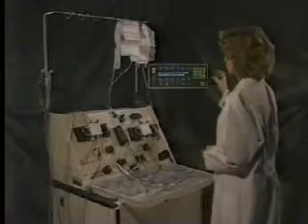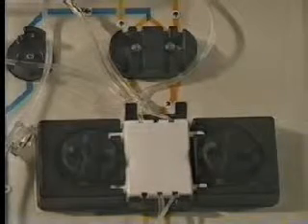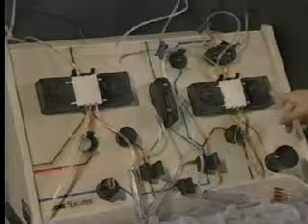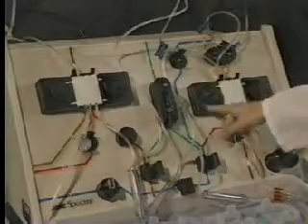Then press the Continue key on the display panel to load the tubing onto the pump rotors. Notice that the cartridge clamps automatically retract and the tubing is threaded onto the pump rotors. The valves open to the load position. Verify that the pumps are loaded and visually check for kinked tubing in the pump rotors.